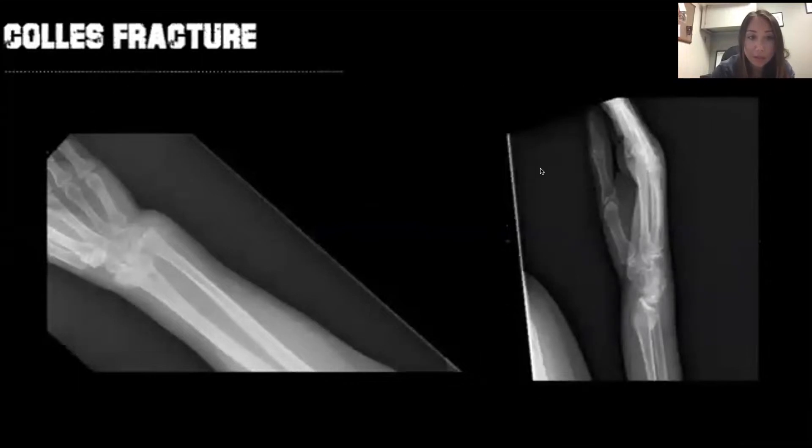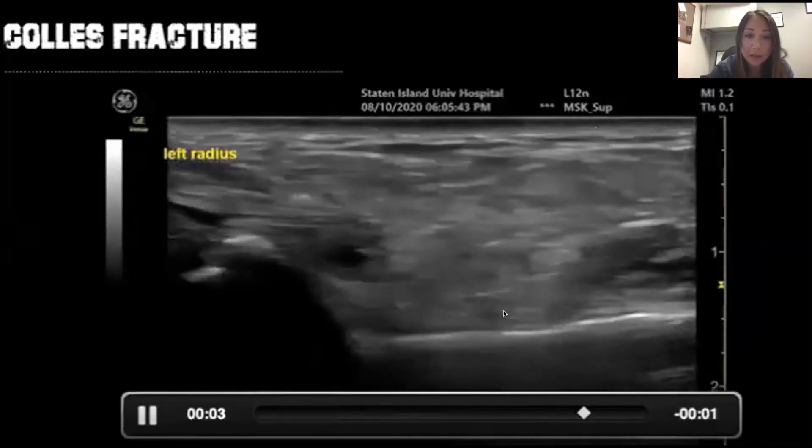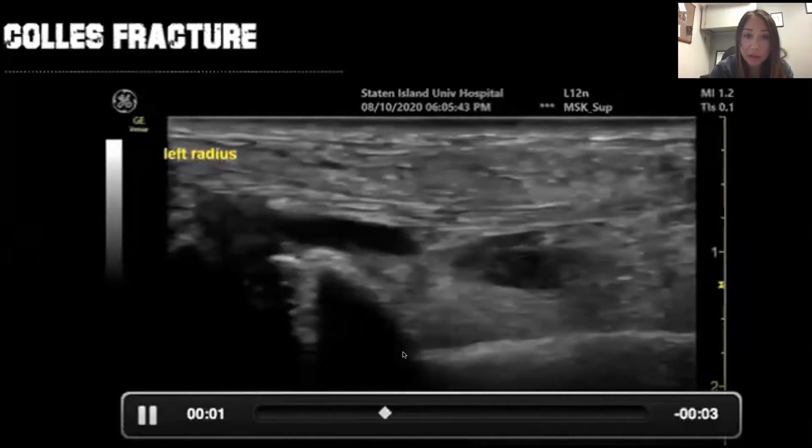Here's just another example from the same patient. You can see that this is the radius, and here is the dislocation.